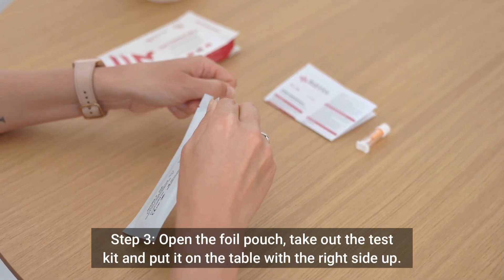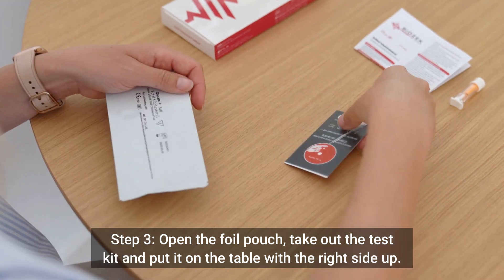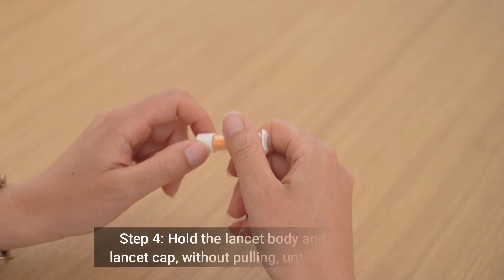Step 3: Open the foil pouch, take out the test kit, and put it on the table with the right side up.